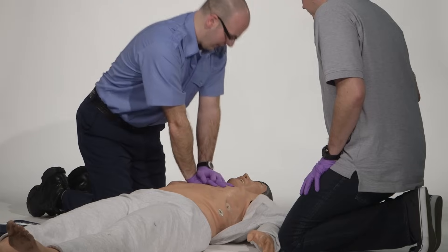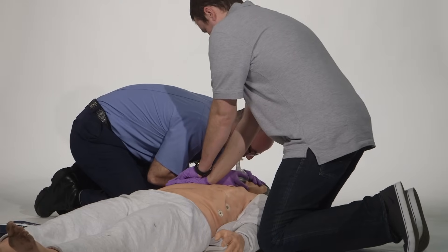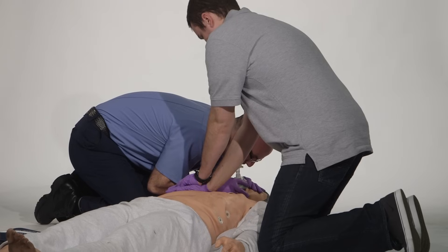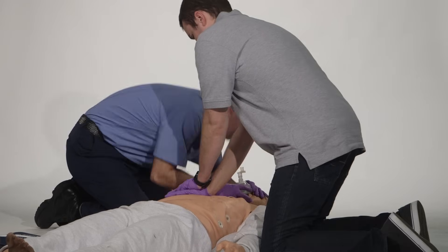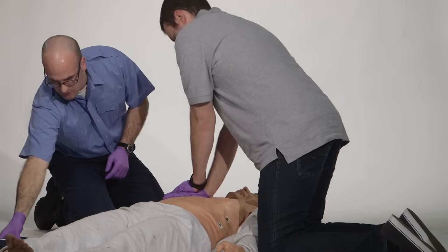That's five cycles. I'll have you continue CPR.